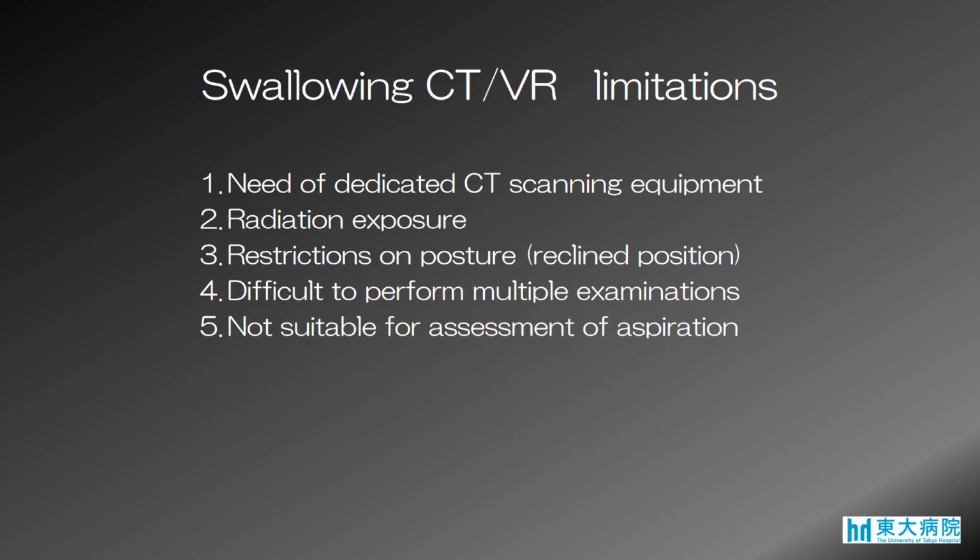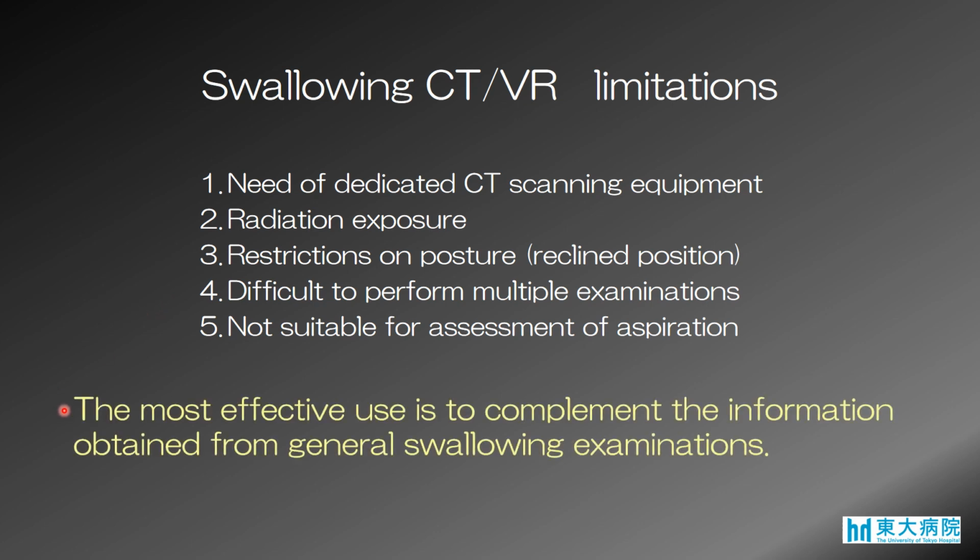However, there are some limitations of swallowing CT and VR: need of dedicated CT scanning equipment, radiation exposure, restriction on posture, difficulty performing multiple examinations, and not suitable for assessment of aspiration. So, we think that the most effective use is to complement the information obtained from general swallowing examinations.